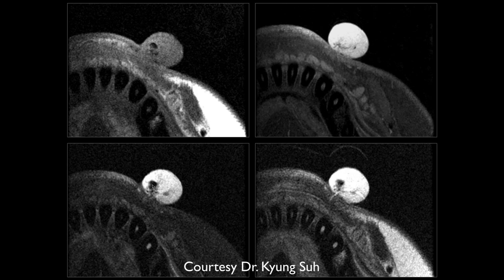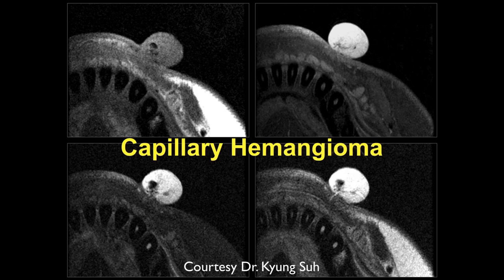Looks like an enhancing, kind of heterogeneous mass, arising from the lip. Skin melanoma. I think there's a spot there. I don't know if that's like a vessel that's going there or.